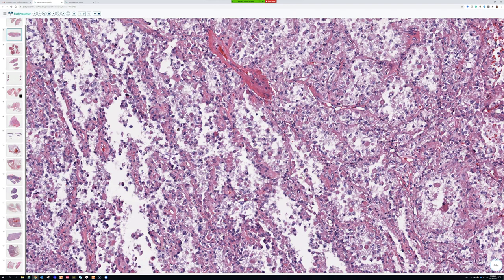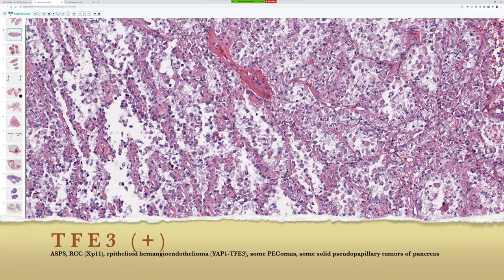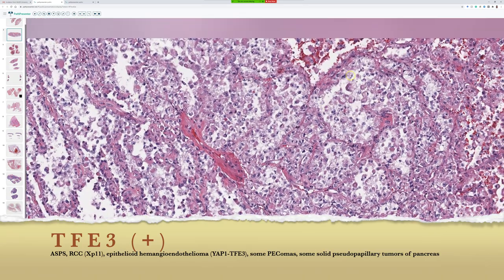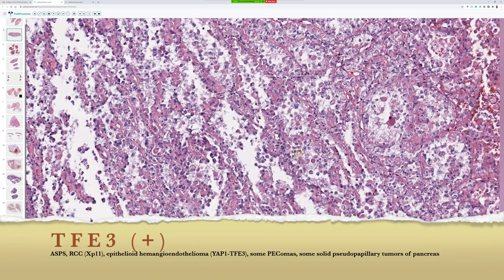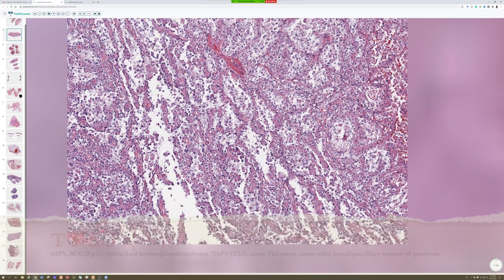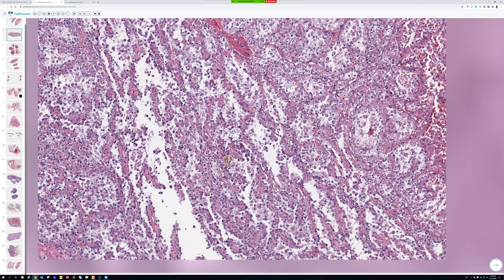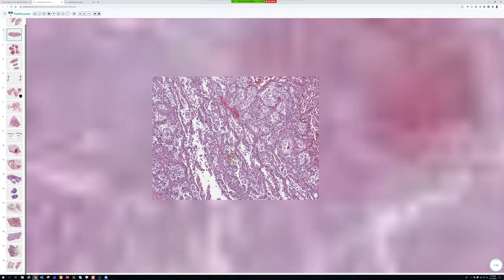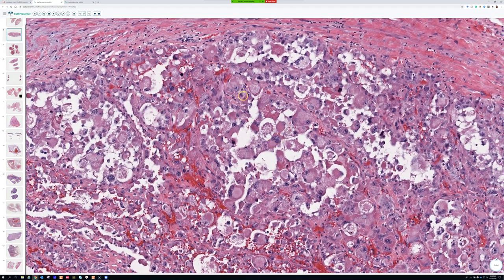What's the molecular abnormality with this tumor? It's Xp11 — chromosome X with the TFE3 gene. TFE3 will stain positive as a nuclear stain in the majority of alveolar soft part sarcomas, but it can also be seen in other entities, so it's not totally specific. When I see something that looks like classic ASPS, the main thing I want to do is perform keratin or PAX8 staining to exclude the possibility of metastatic renal cell carcinoma, which is of course much more common than ASPS.